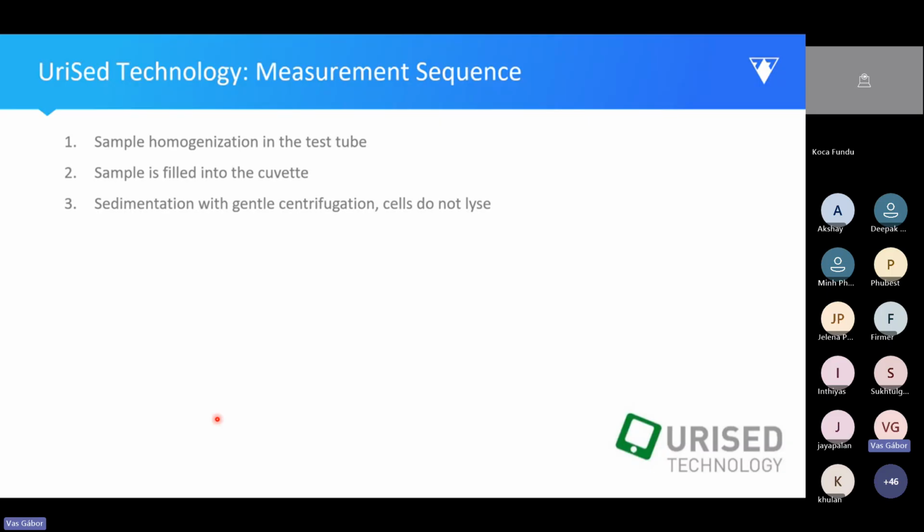Any other urine centrifugation technique involves almost double the G, so this is 260, and normally you do it at 400 G for 5 minutes. So we can see the difference between 10 seconds and 5 minutes with half the force.